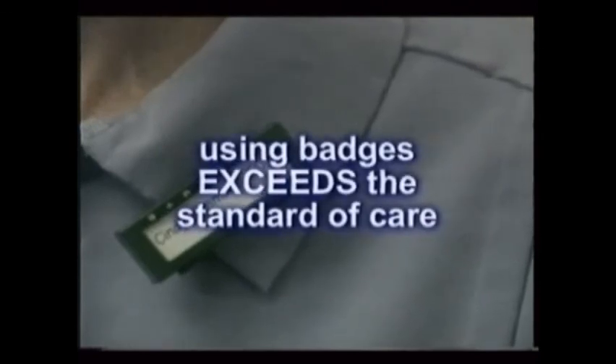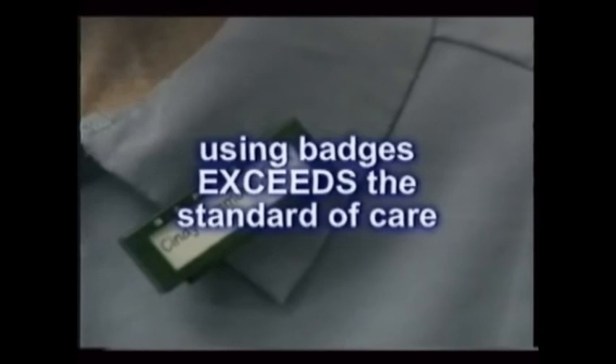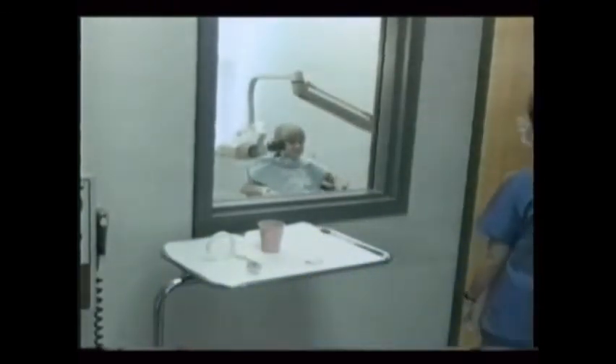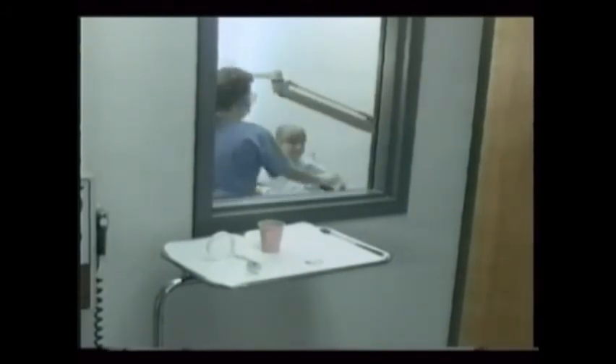Many dental offices that strive to exceed the standard of care do use x-ray badges, though. Like wearing scrubs, it certainly makes the group look more professional. Not needing the monitoring badges doesn't mean that the doses are so low that you can get sloppy. Only staying out of the field of x-ray yourself keeps you safe in your day-to-day use of dental x-ray. Nothing else will do it.